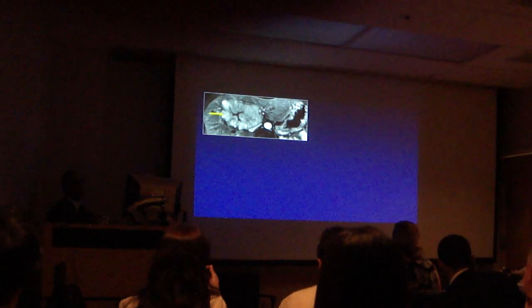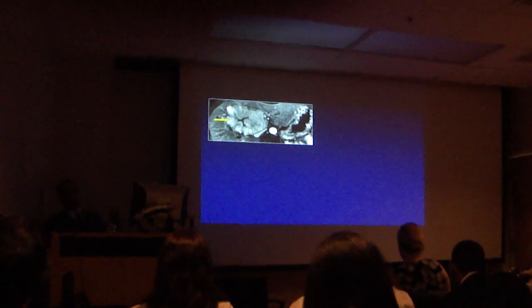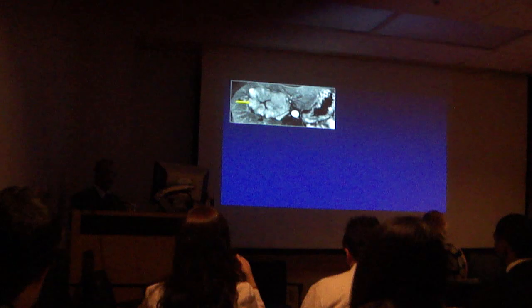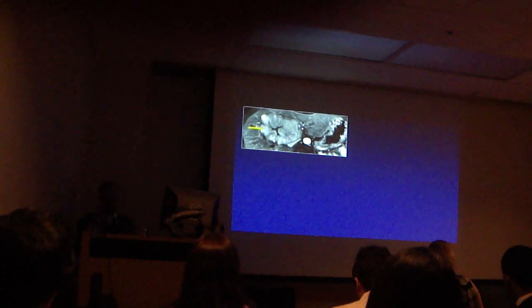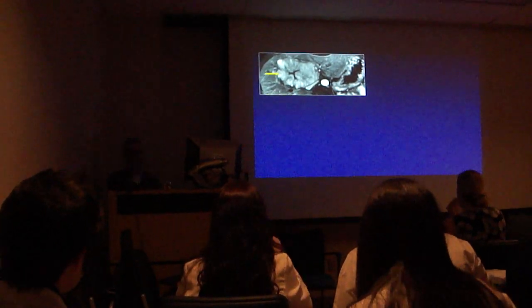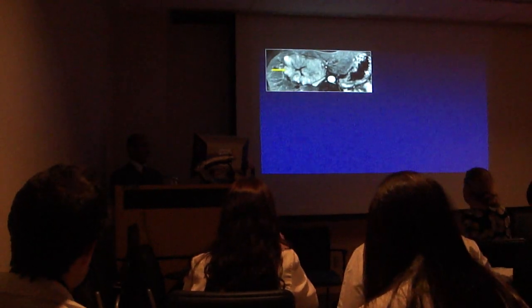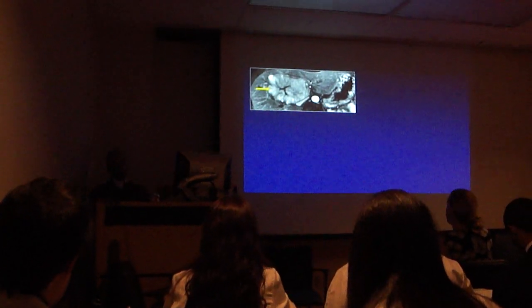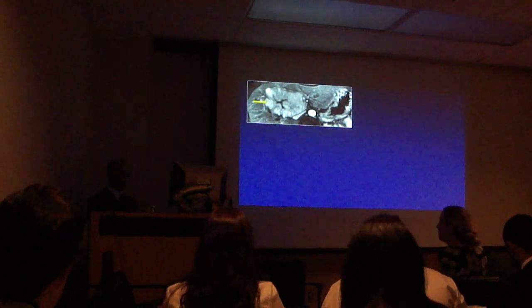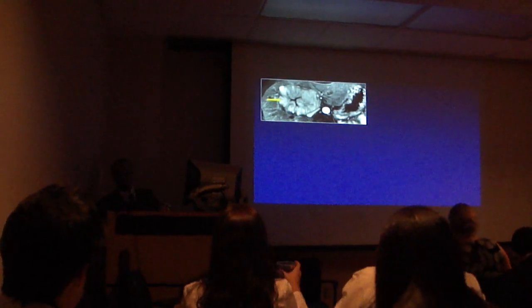Exactly, well defined. So one of the characteristics, and there's a lot of detail, but life is black or white, like day or night, and the shade of grey is only 5 minutes at sunset and at dawn and dusk. That is how nature is, and that is how God created the universe. Try and follow how the universe is, black or white. Don't try to live in shades of grey, and people do, unfortunately. So either it is infiltrative or it is not. Infiltrative is a worrisome feature.